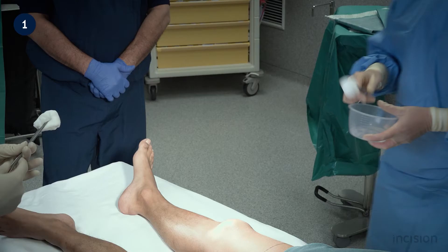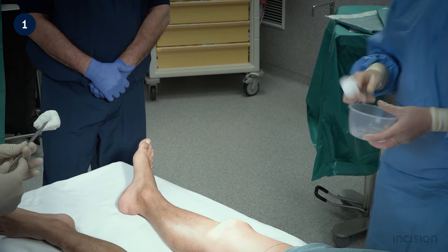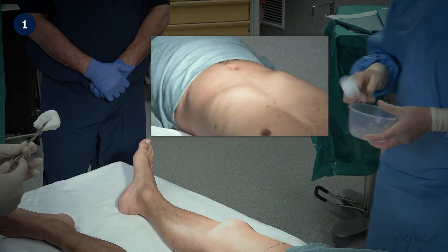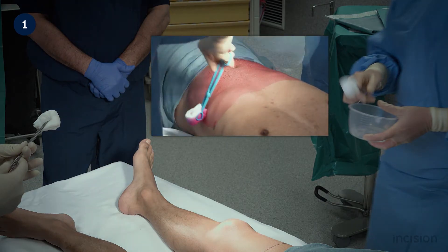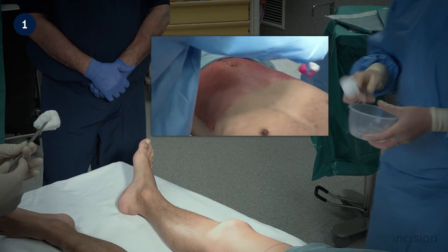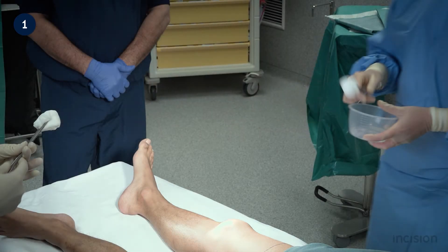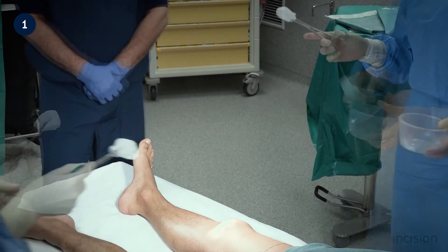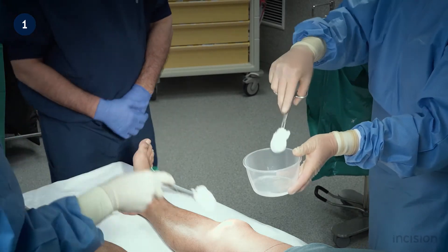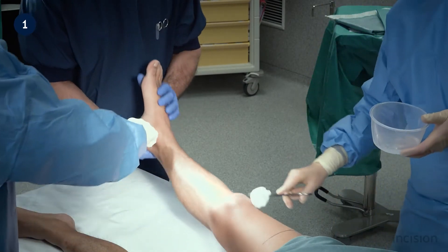In this film, cleaning and draping techniques will be demonstrated on different parts of the body using a patient model. To expedite instruction, chlorhexidine with tint will be seen used only on the abdomen. Elsewhere, the area to be cleaned will be demarcated using a highlight and cleaning then simulated as shown. This allows the view of landmarks and structures to be maintained.